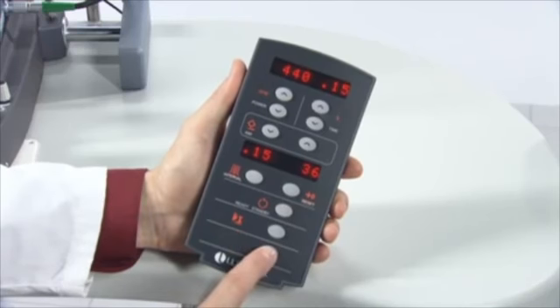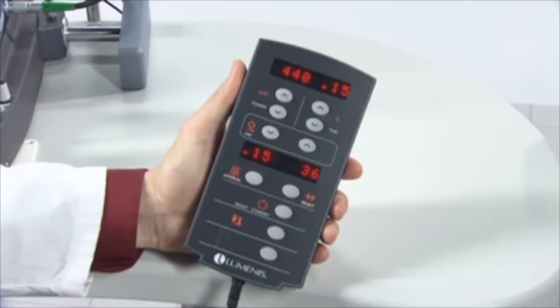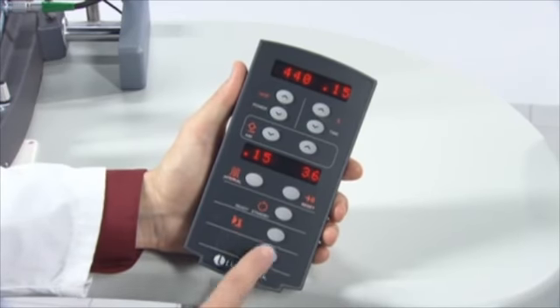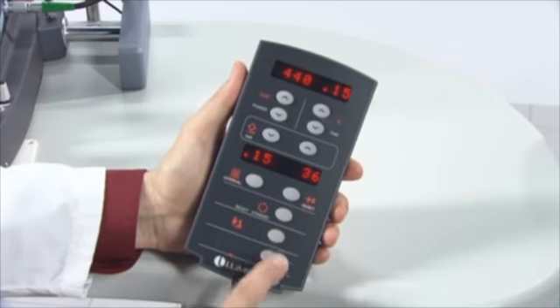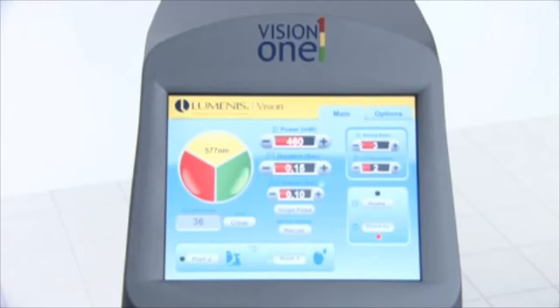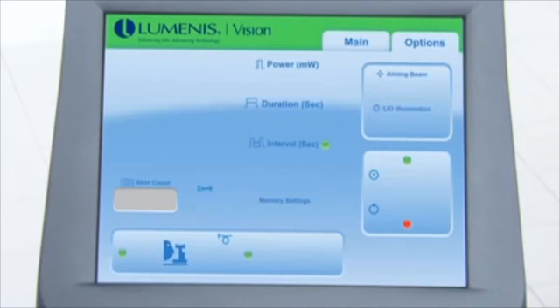To select the laser color from the remote control, press the laser color selector until the bar for the desired color illuminates. If you have multiple delivery devices connected to your Vision One system, you can select the desired device through the remote. The delivery device field displays icons representing the delivery devices that are currently connected to the fiber receptacles on the front of the laser console, representing the LaserLink Z or InSight, the Aculite EndoProbe, and the Heine LIO or Keeler LIO. X represents no delivery device connected.